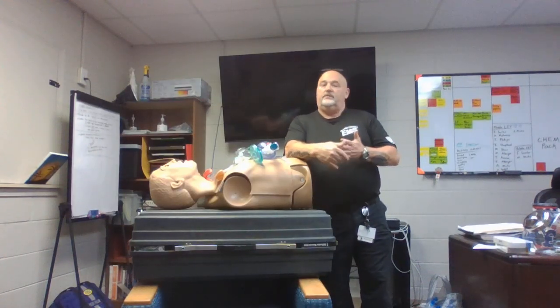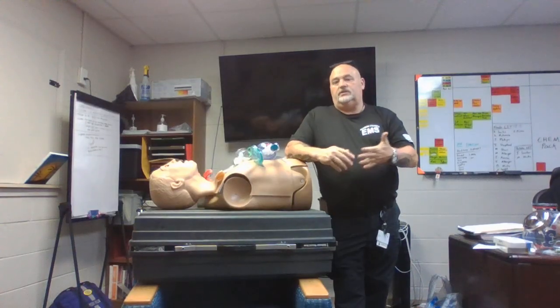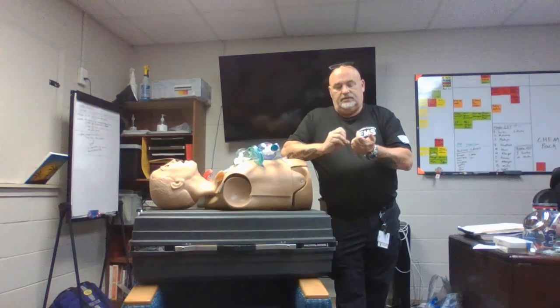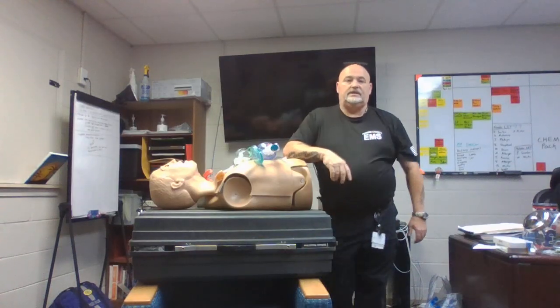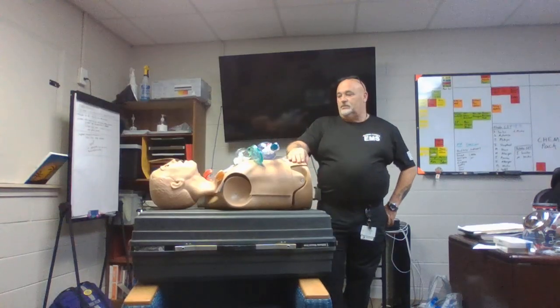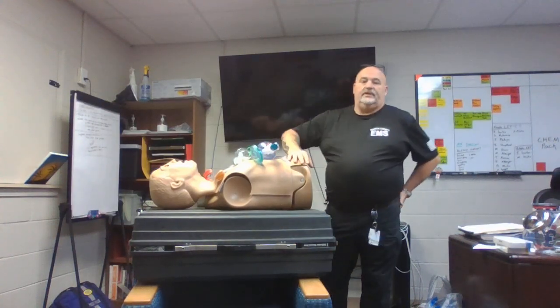Everybody said, oh, and for the medics and the advanced and the higher certified providers, they're going to jump straight to a tube. It's the gold standard. Yes, I will not disagree that it's the gold standard. But do we need it all the time? No, we don't. We forget the BLS side of it. So the BLS is very important for you, for your patient, for the hospitals. The less invasive you can do to maintain it and is maintaining well without a problem, I recommend it.